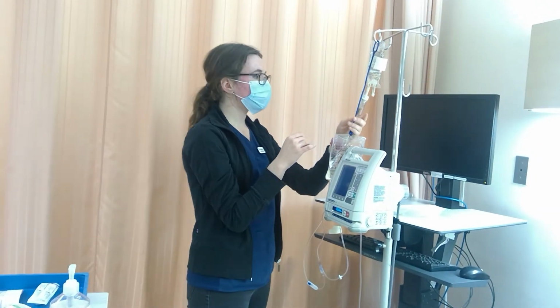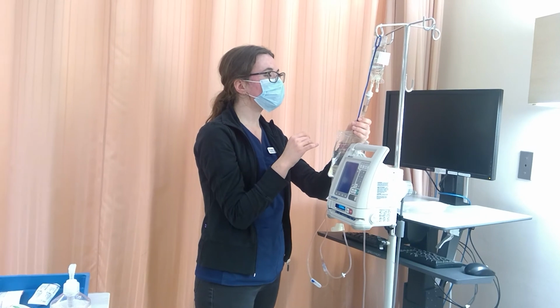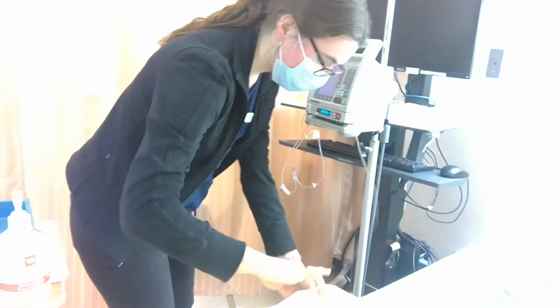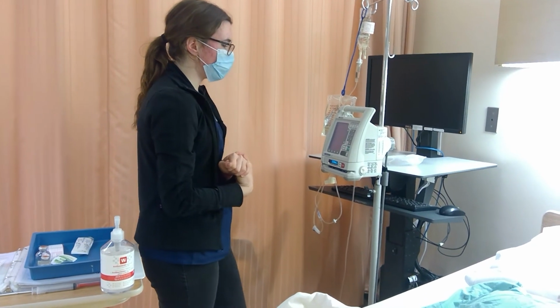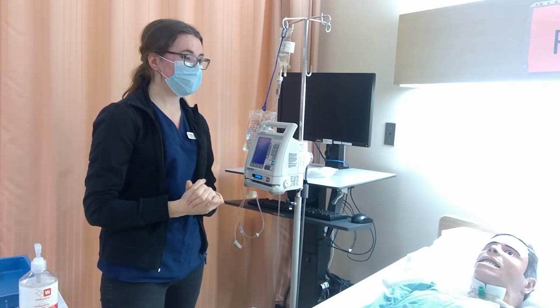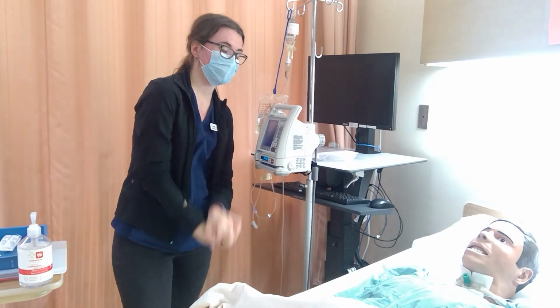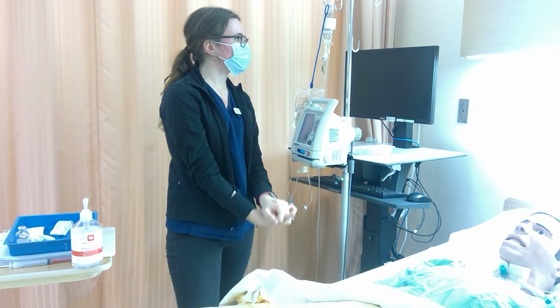So I'm just going to be looking for 3 drops. 1, 2, 3. Okay, so there's 3 drops. So the medication's running. All the ports are open. No kinks. It all looks good. So now I'm just going to check in with the patient. I'm going to be back here in about half an hour once the medication is done infusing, and I'm going to bring a 15 cc flush with me just to make sure that you get the entire dose of medication if necessary, right? So we're just going to be back.